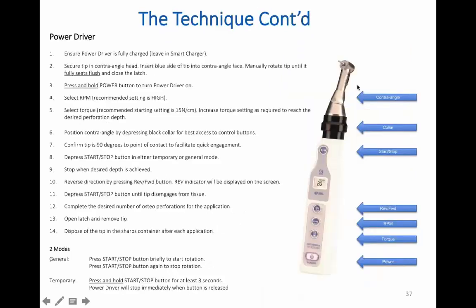This is the electric handpiece. Now this is again a latch type handpiece. This is the single use, we'll call it a burr. The single use device that you'll use here. It's a contra angle, and again it turns at 30 revolutions per minute.